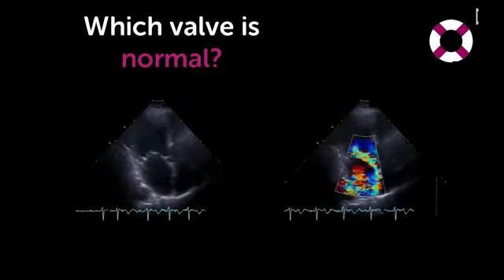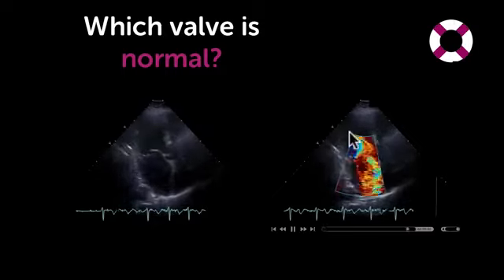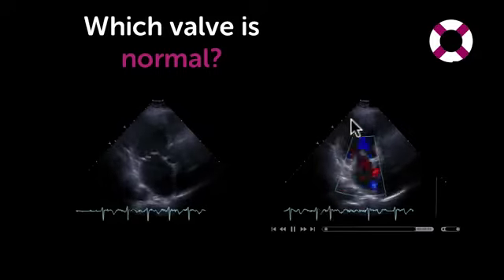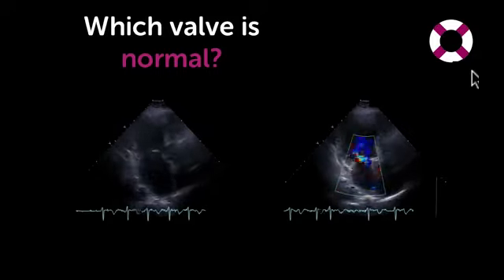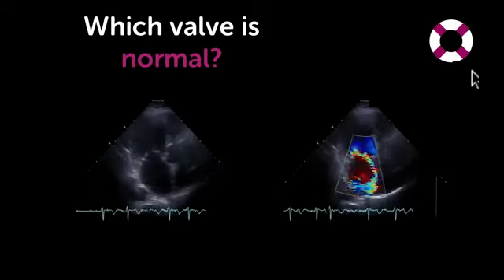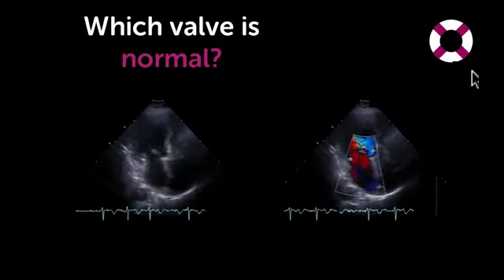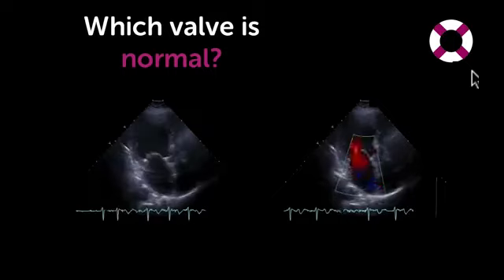And is there mitral regurgitation? Sure enough. Mitral regurgitation is not only severe, but it is very severe, as you will later understand when we come to color Doppler. A very important point I would like to make is that the morphologic abnormalities do not always correlate with the severity of mitral regurgitation.